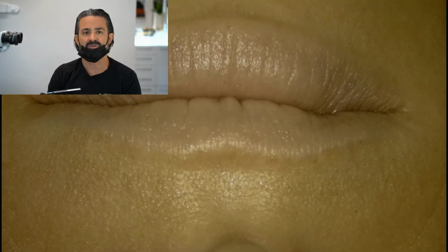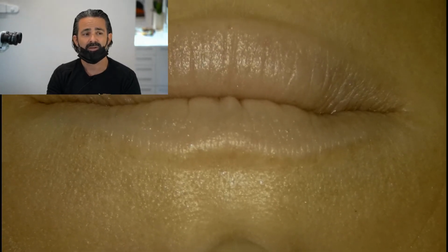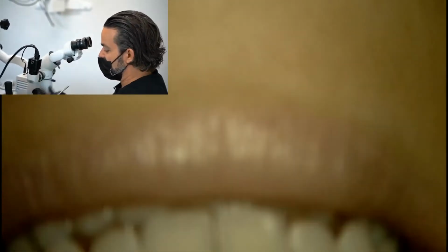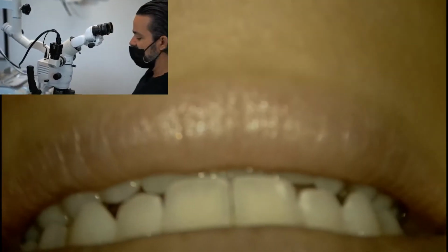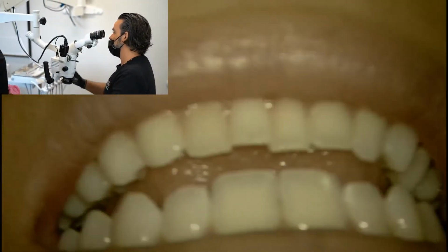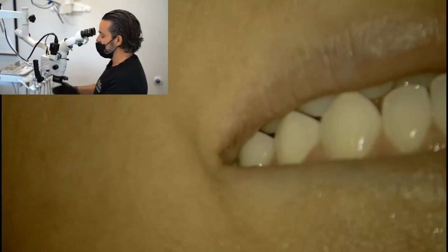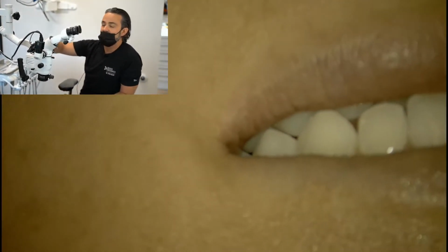The other thing with surgery, if you really want to know these details, I really turn down the power. When you're doing a surgery on something, you tend to actually get really close, down to like the 200 range. There's not a lot of splashing, and I'm really dialing in. And when you get close, you generate a lot more heat with the light, so I really will have it down on a low setting.